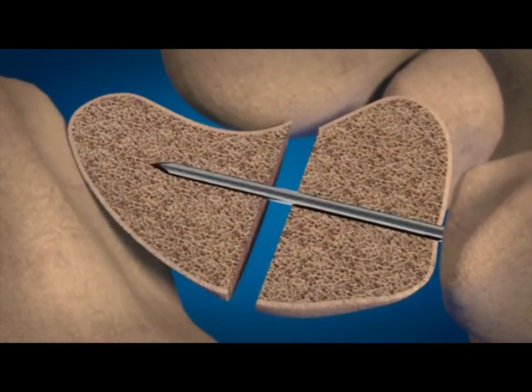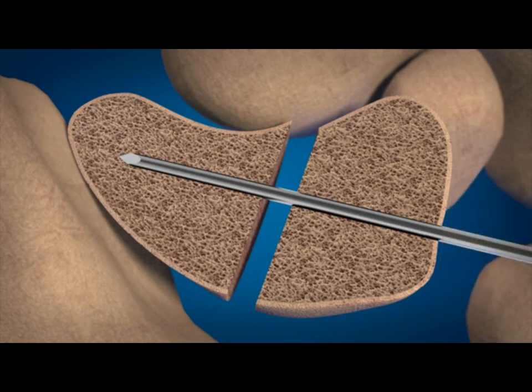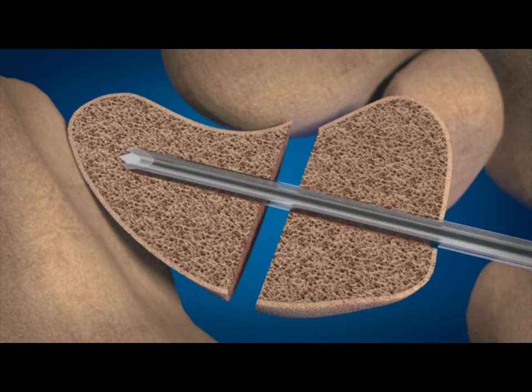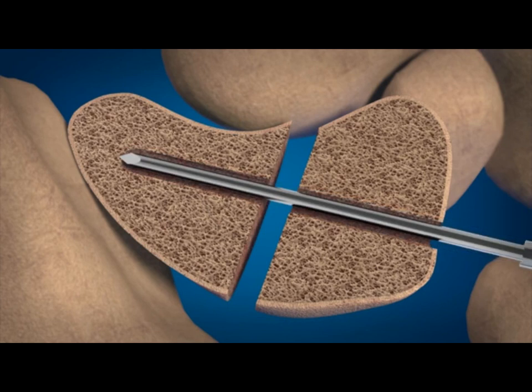Insert the guide wire to the desired depth. Drill over the guide wire with the appropriate cannulated drill bit. Remove the drill, leaving the guide wire in place. Advance the depth gauge to the intended position of the trailing end of the screw and confirm placement under fluoroscopy.